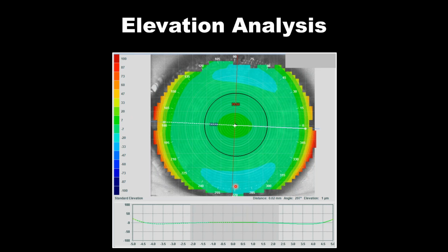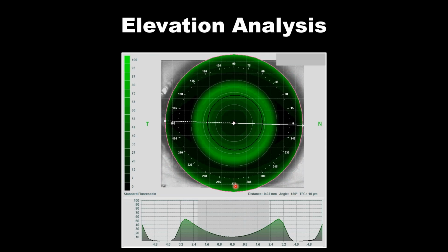You need to understand height and as much of that height as you possibly can collect. As an example, most corneal topographers have their own indigenous contact lens software that allows you to place a lens on eye. The one downside of corneal topography software is that it's limited to the lenses that are available in their system. So EyeSpace, as an example, is its own software platform, which gives you access to all the various designs that are in there.